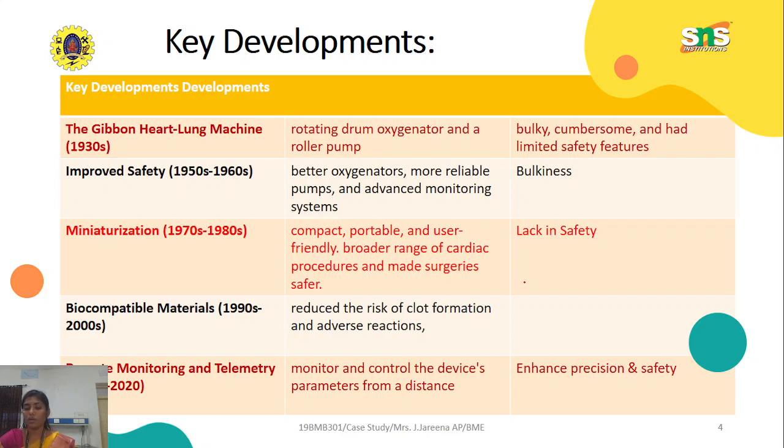It becomes less used in hospitals. That is one of the drawbacks. So biocompatible materials, that is biomaterials, come into the picture.